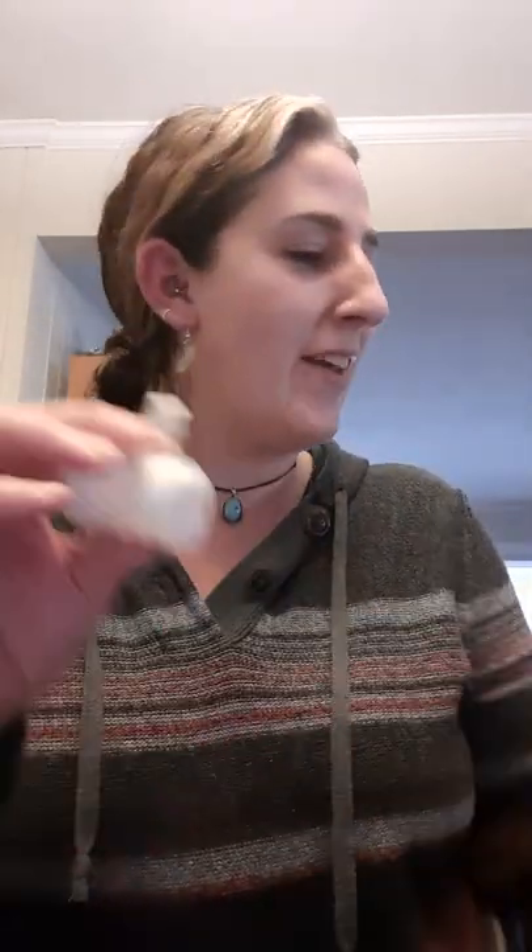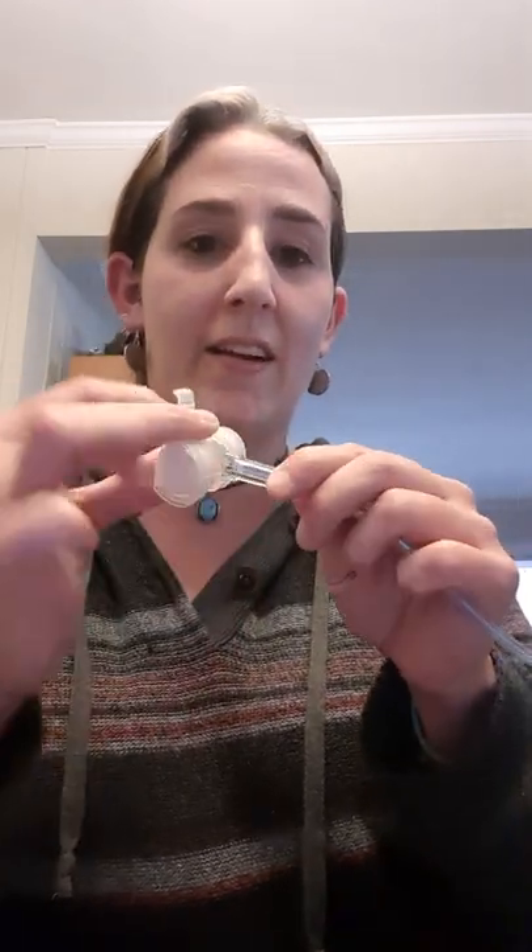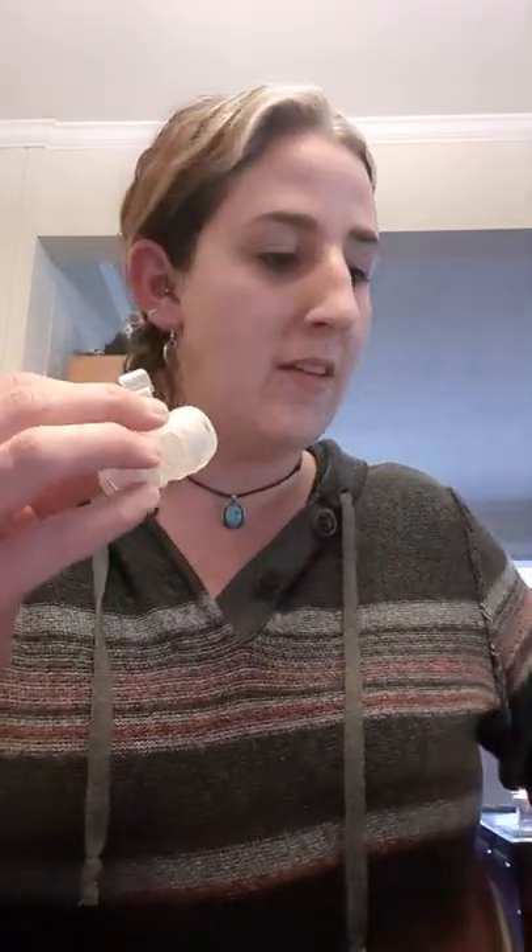What I had been doing was stuffing this end in here and taping it in place. Again, not great.